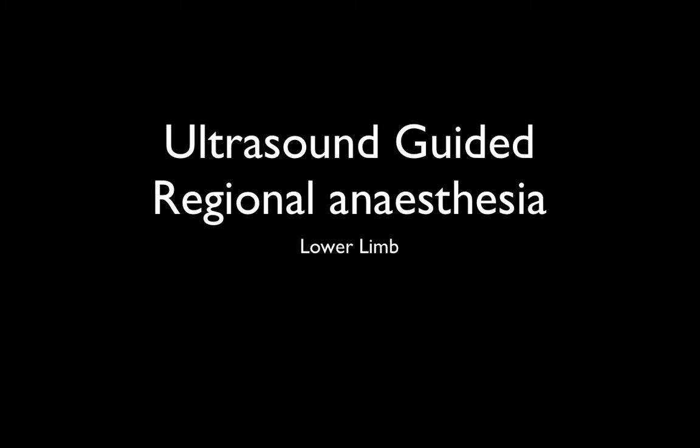Final chapter in the ultrasound guided regional anaesthesia. Today we're going to look at lower limb, and specifically the femoral nerve, the fascia iliaca plane block, the popliteal sciatic and the saphenous nerve blocks. So first off, the femoral nerve.